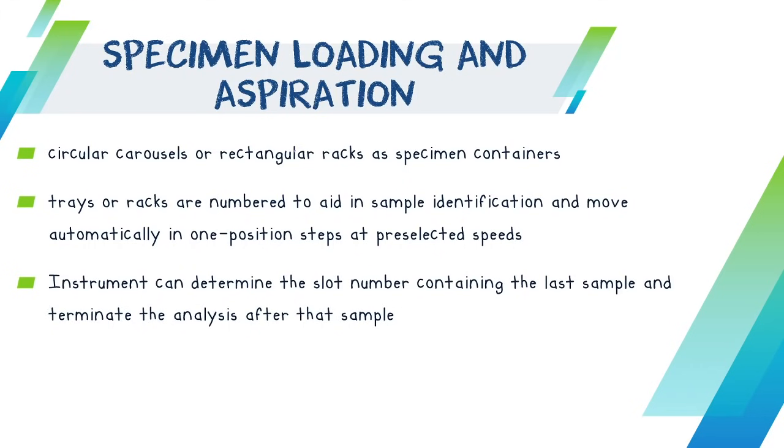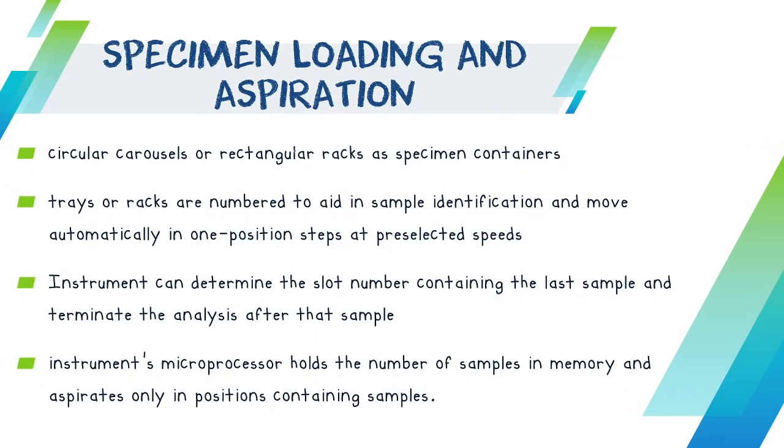And then instrument can determine the slot number containing the last sample and terminate the analysis after that sample. So yes, ingani ang inyong mga auto-analyzers na by the time that it will reach at the last specimen that you've encoded, then the whole processing will just stop or halt. It can actually determine that. Then instrument's microprocessor holds the number of samples in memory and aspirates only in positions containing the samples.